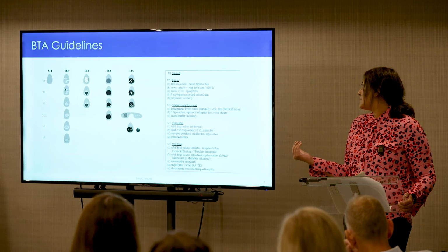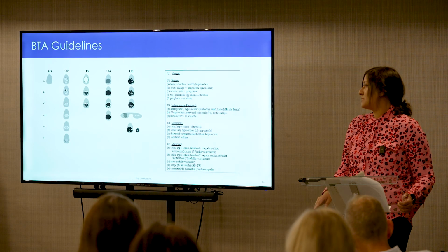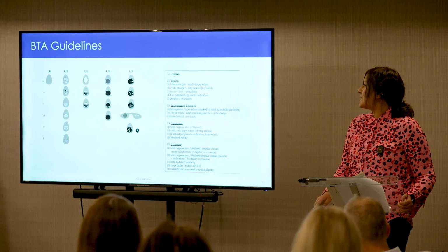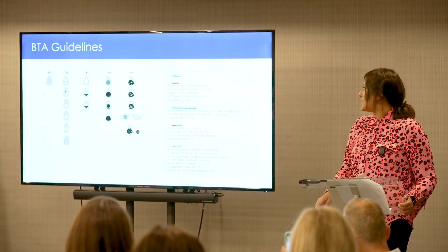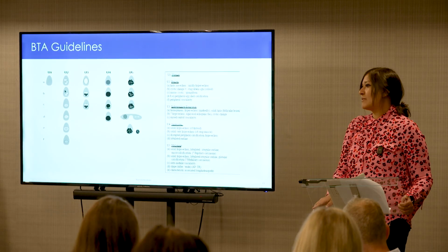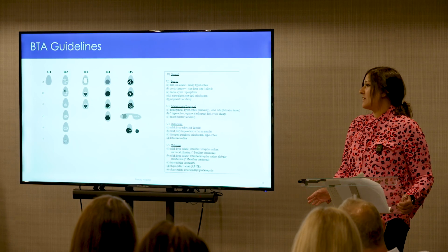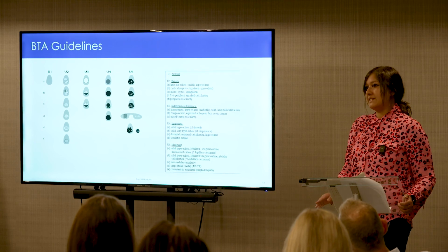So this is just the ultrasound chart that we use, and it's actually something you'll find in most radiology ultrasound rooms in any radiology department. Some people have varying sort of interpretations about how helpful the pictures are. The main thing to take away from this would be this chart and its descriptions. I would recommend using these descriptive terminologies in all of your reports. And it just helps you justify why you think a nodule is a grade, and it just makes your report more clear and easier to understand.